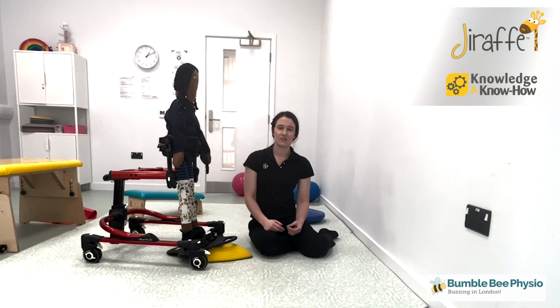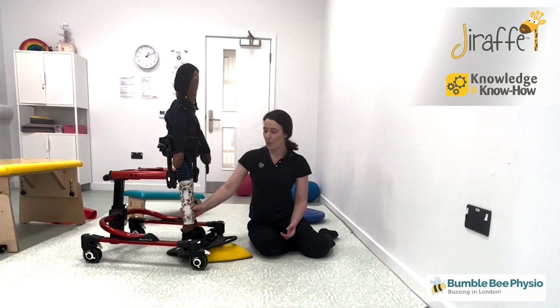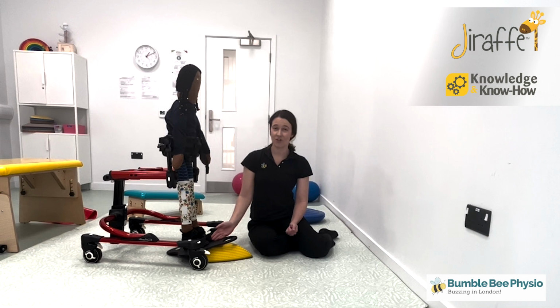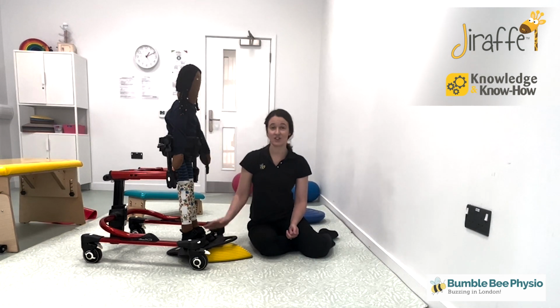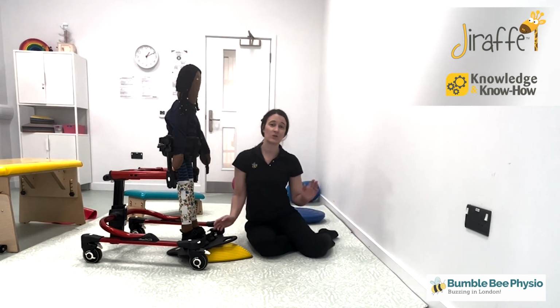So after you've seen that close-up video of how to isolate the gastrocnemius, you can now start to build in more active and dynamic movements into that calf muscle stretch. So when your child has stood there with all of this set up, then you can start really, really activating that stretch by doing some reaching.